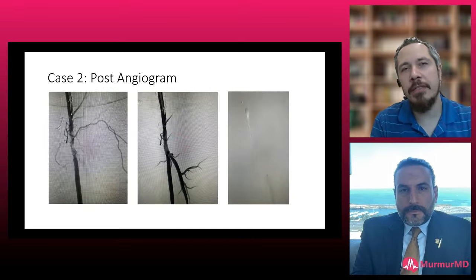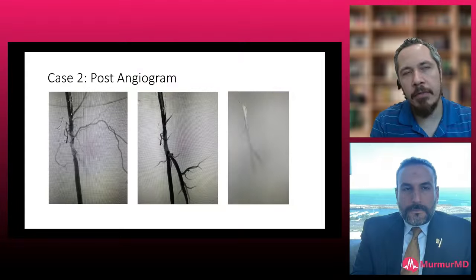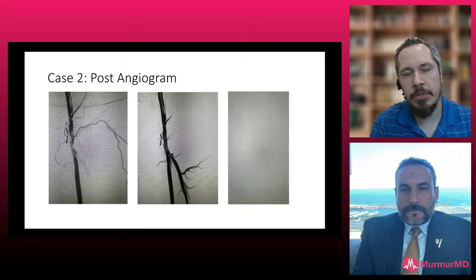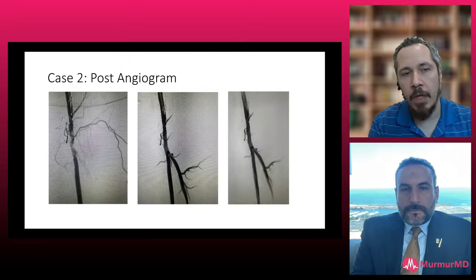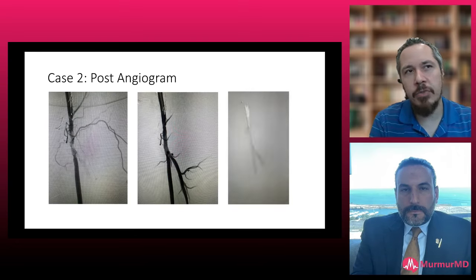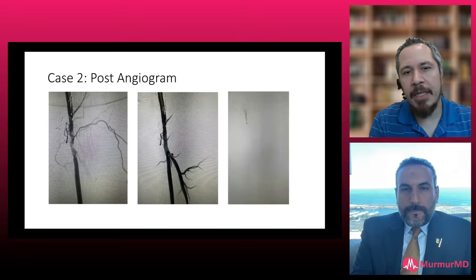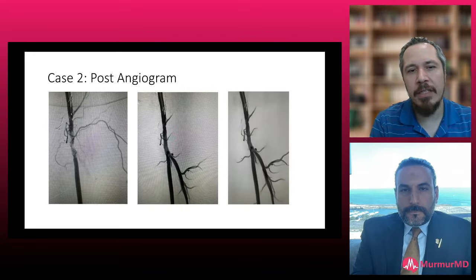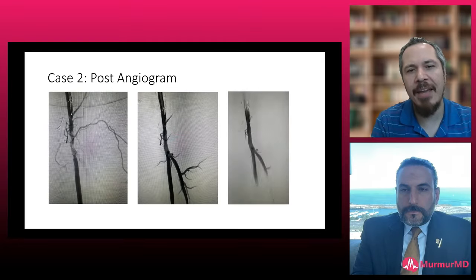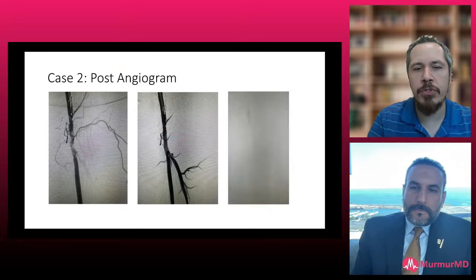I really try to avoid stenting in the common femoral. Common femoral for me is what we use for our cardiology work most of the time with Impellas and TAVR and all the other stuff. And again, she's a young lady. She's in her 60s, so she has at least 25 years to live, if not longer. But to me, if I end up getting a complication there, as long as I can have the situation controlled and no acute limb ischemia, I try to get it controlled and then send her for surgery for repair.